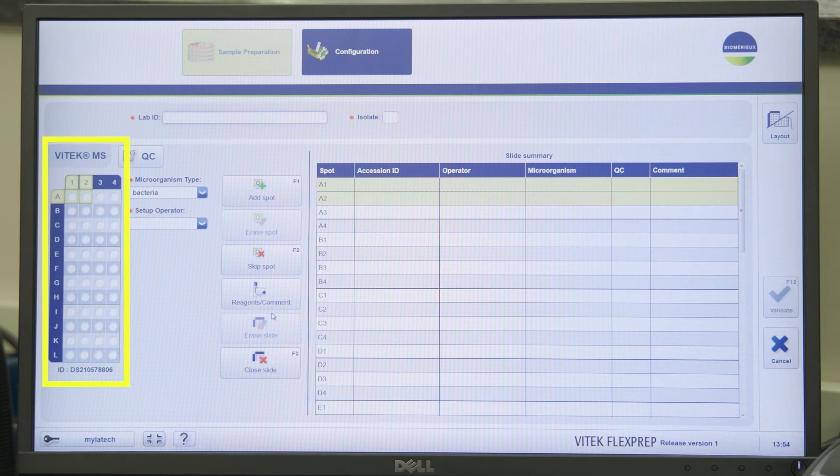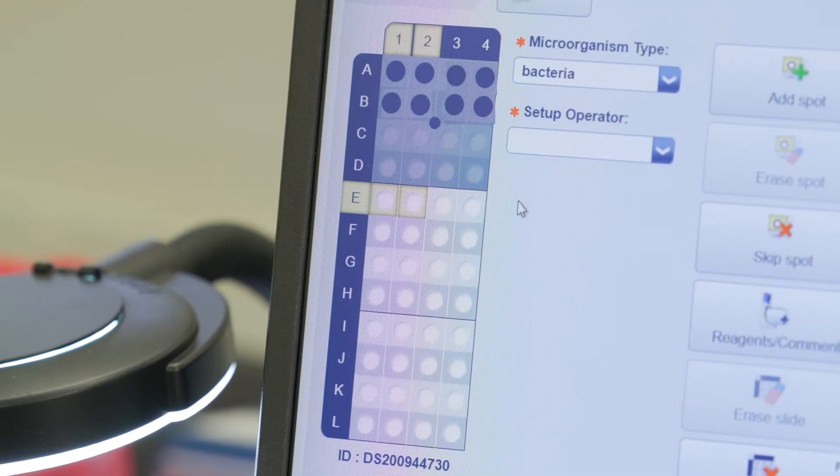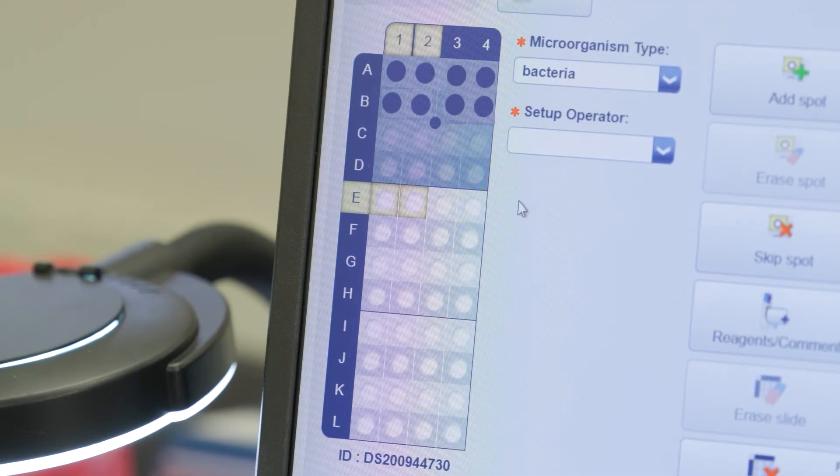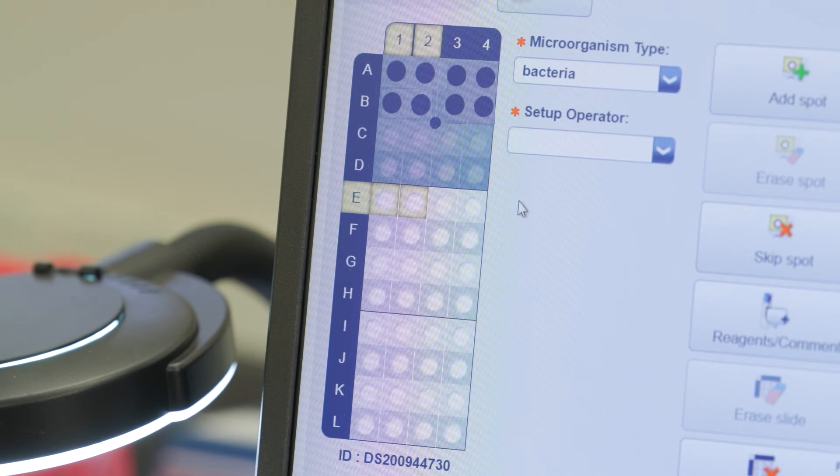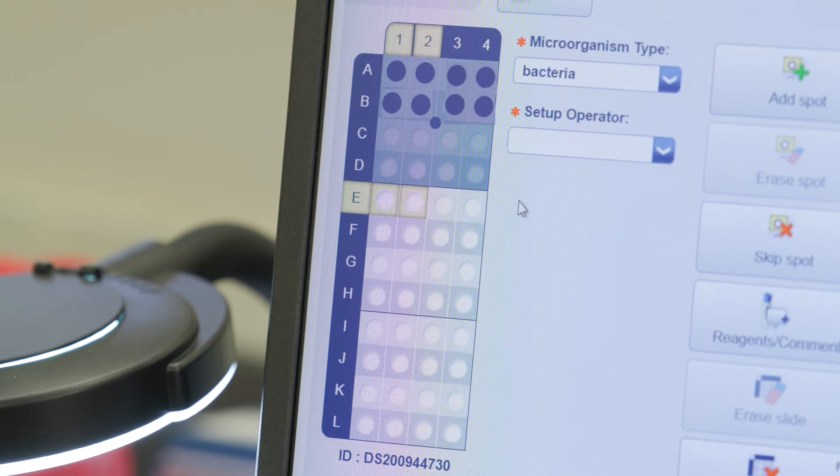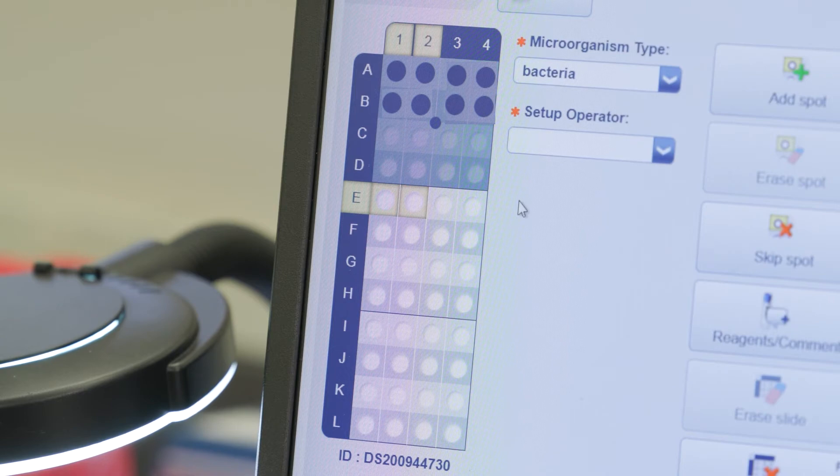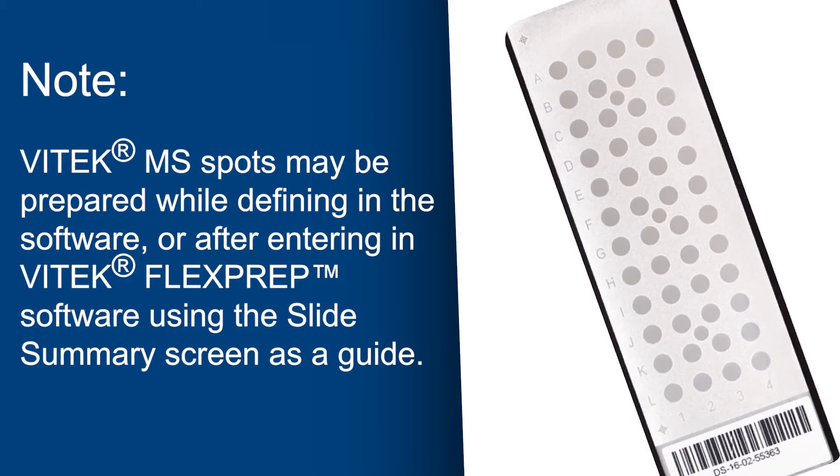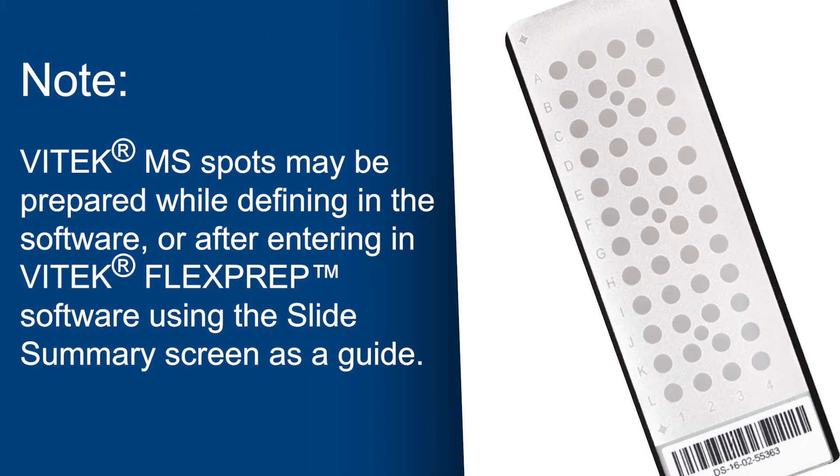A graphical representation of the slide appears. Acquisition groups on the slide which have been previously acquired will appear in gray as they cannot be used again even if empty spots remain. Note, Vitec MS spots may be prepared while defining in the software or after entering in Vitec FlexPrep software using the slide summary screen as a guide.